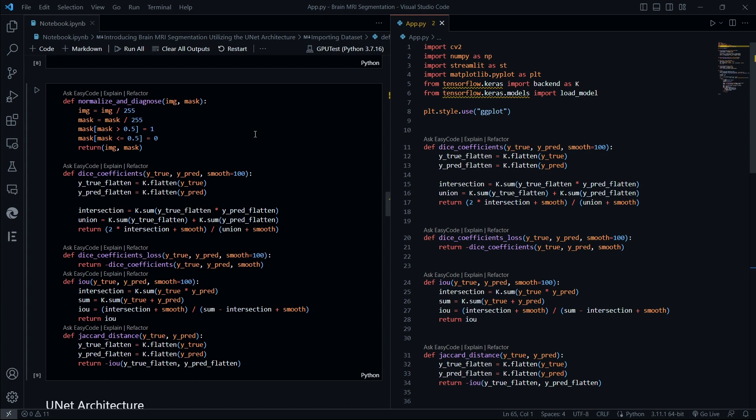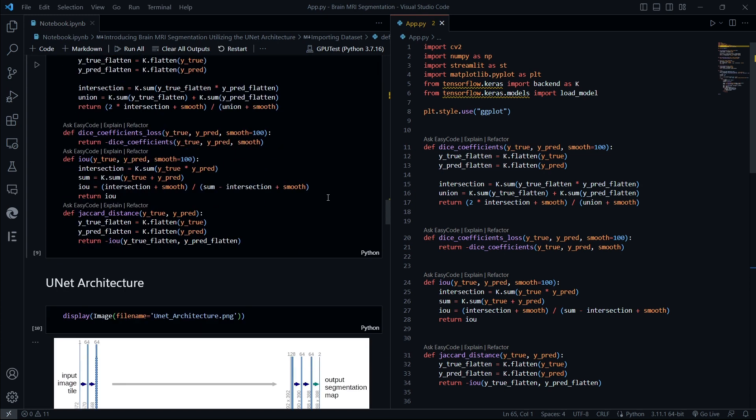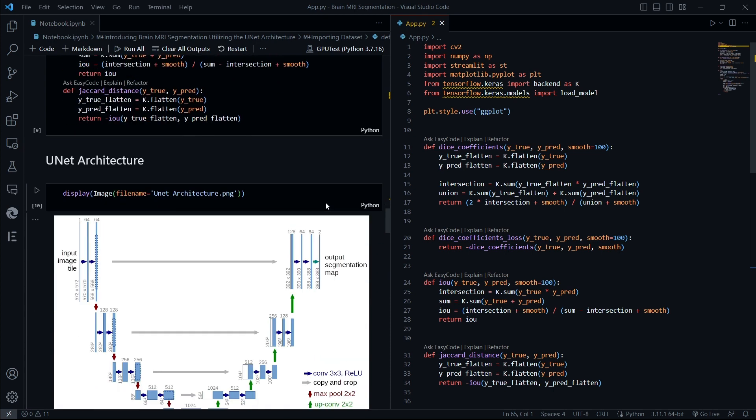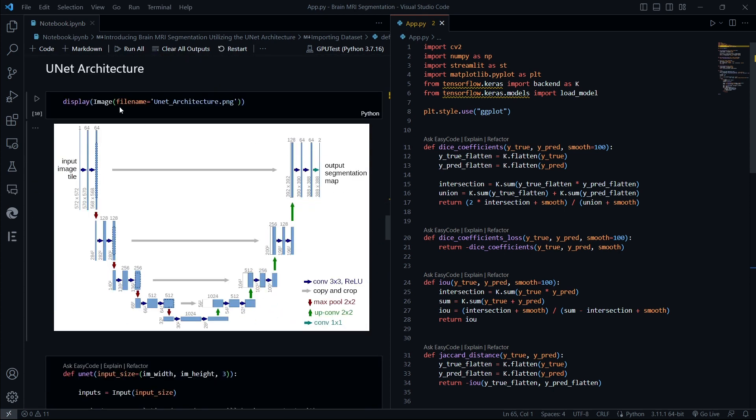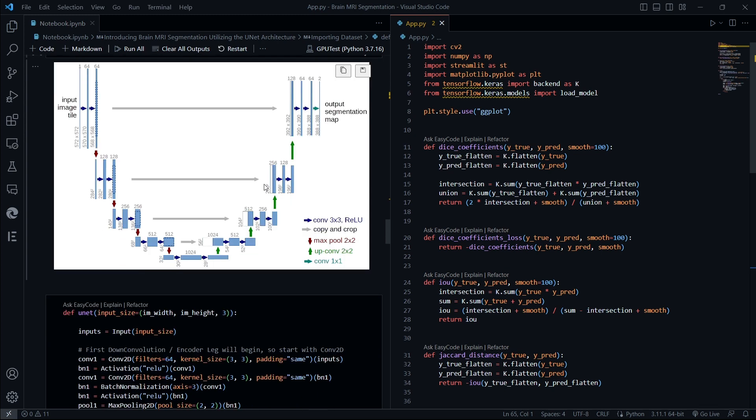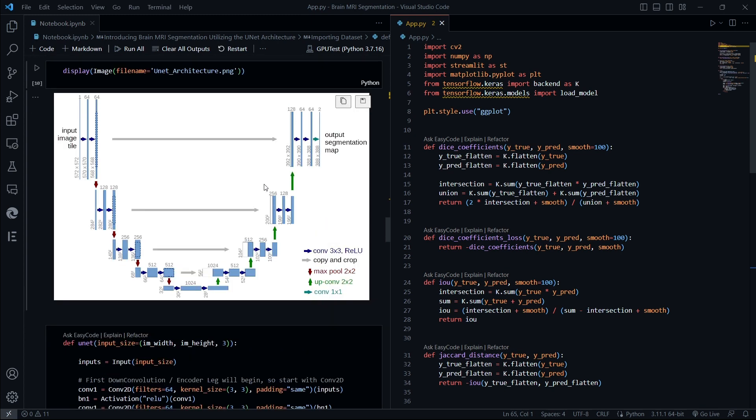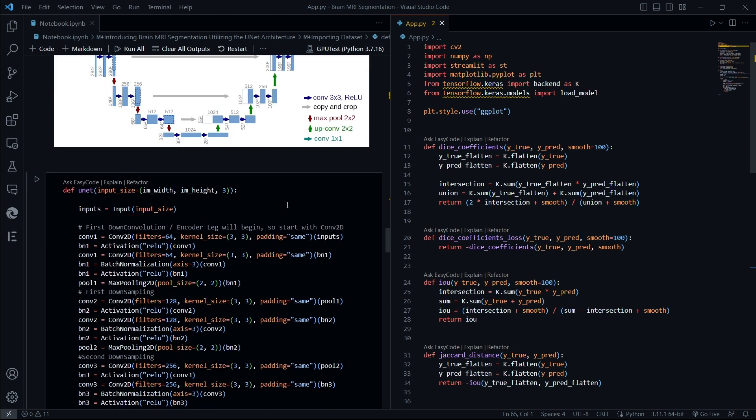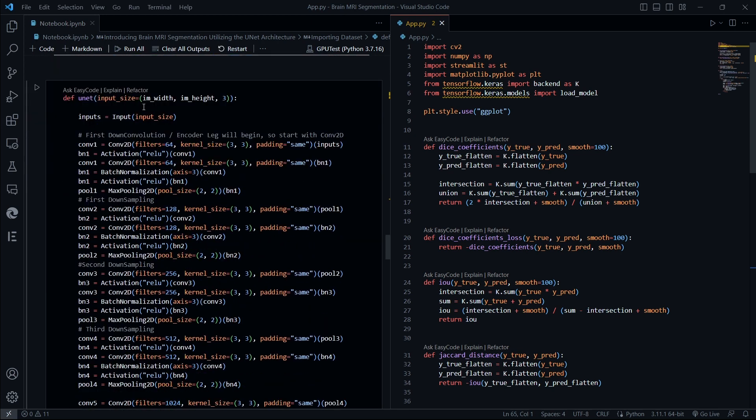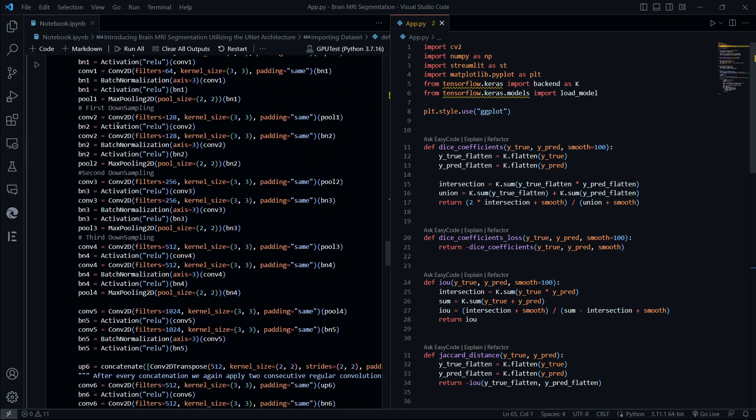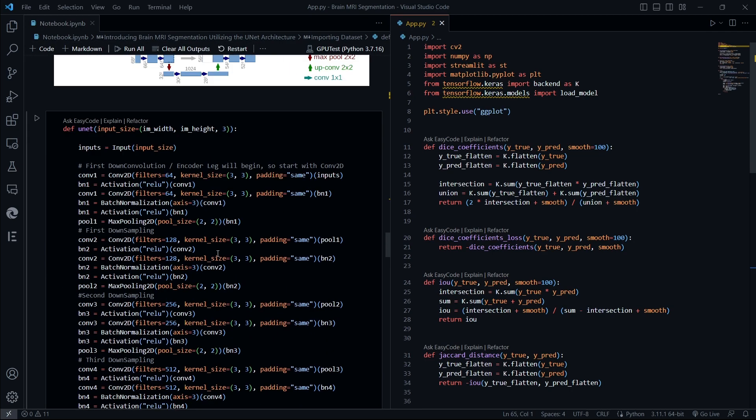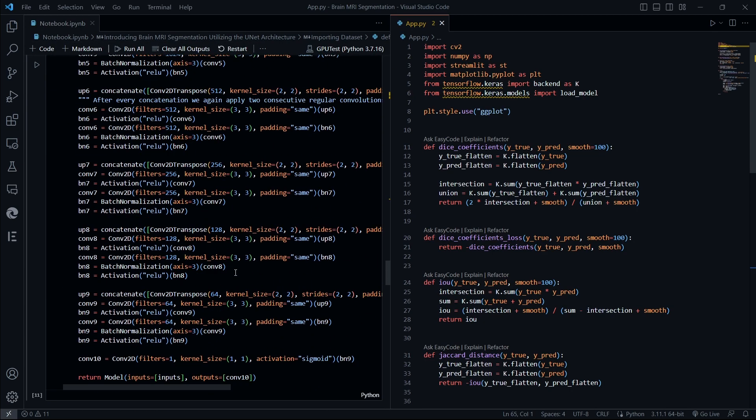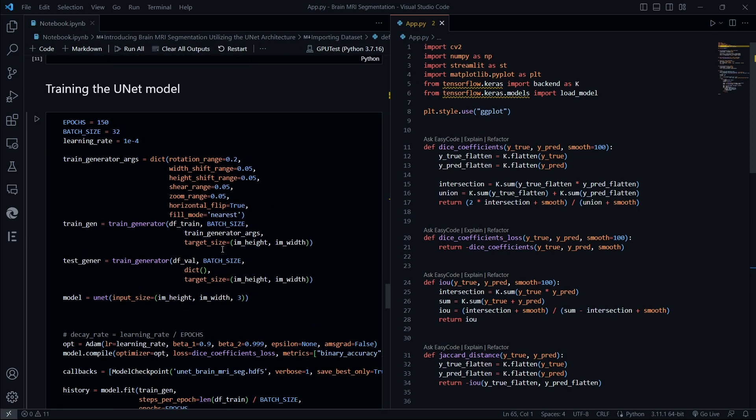These are the normalization and the dice coefficients—or you can say losses and optimizers—of our neural network. As you can see, this is the U-Net architecture, which is one of the most crucial parts of our neural network. So here this function U-Net defines the whole U-Net architecture that has been shown in this image.